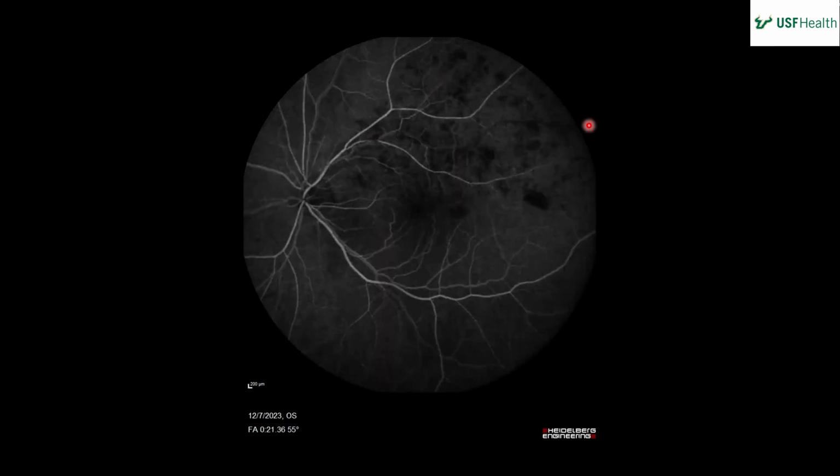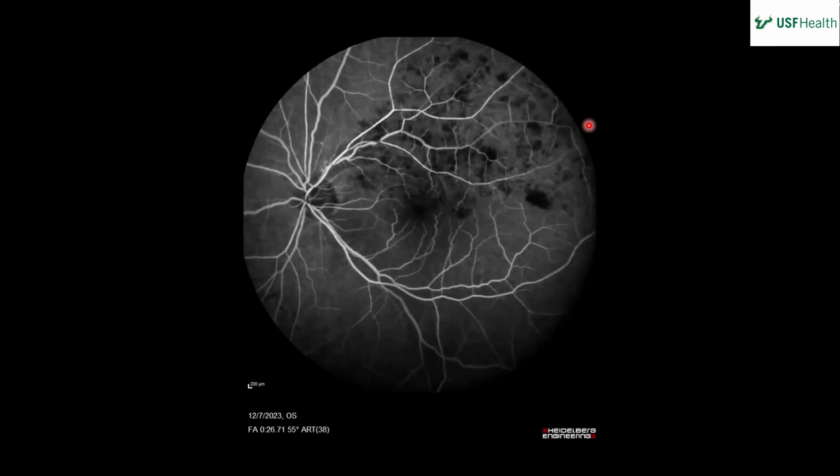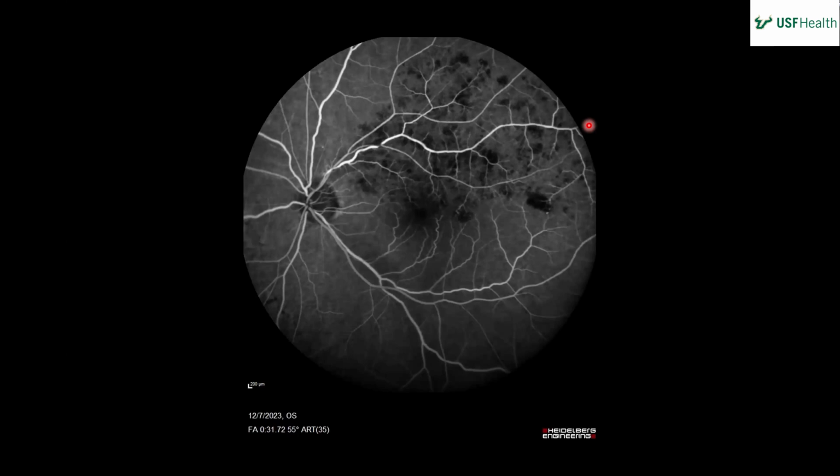And do you think there's differential filling of the vessels on the top and the bottom, the veins specifically? Yes, I guess it's filling more on the bottom, especially when you go back and forth. Differentially, it looks like inferior is filling more. Superior is not quite full, not really filling as much. Not for long, though. Now it's pretty full. Maybe it was filling earlier inferiorly, it's still more so inferiorly, later superiorly.